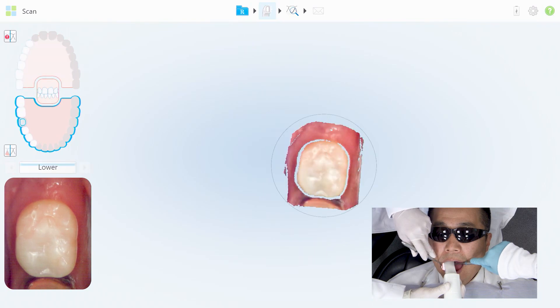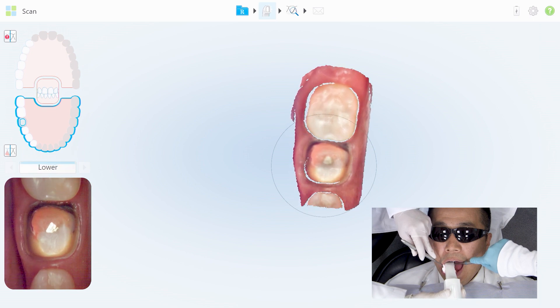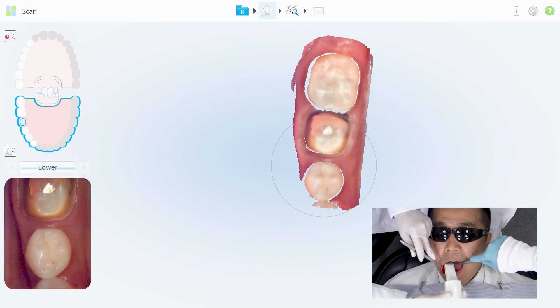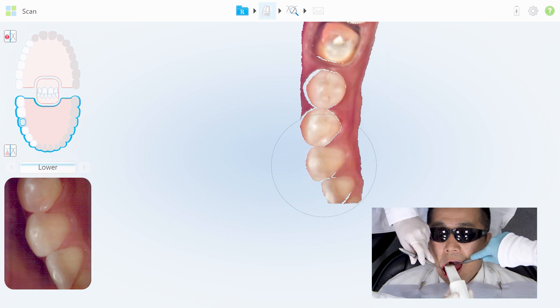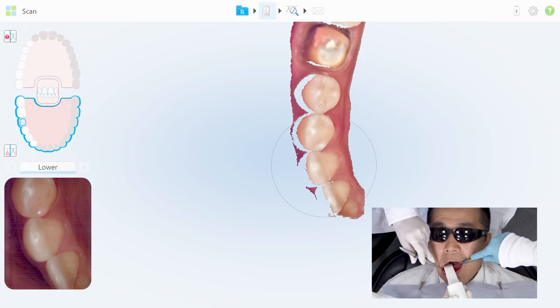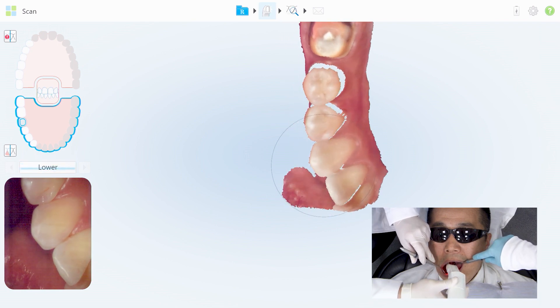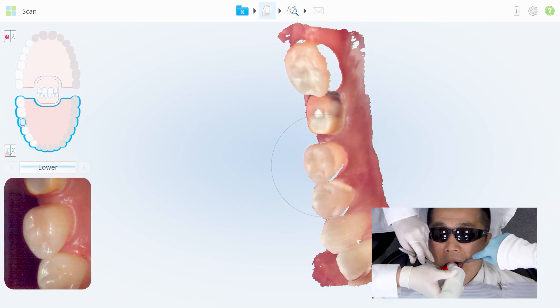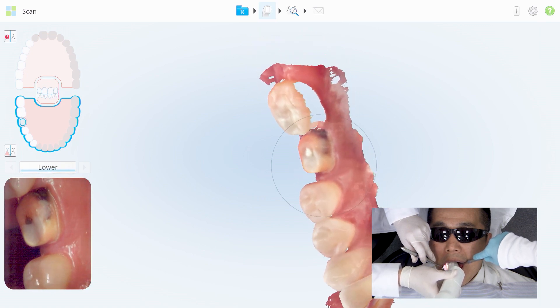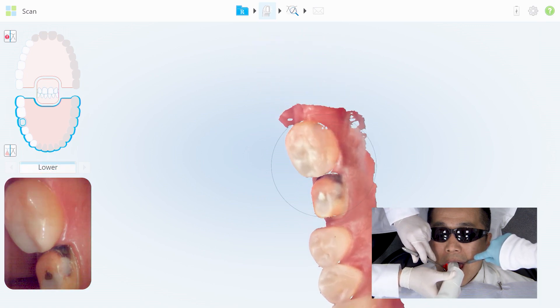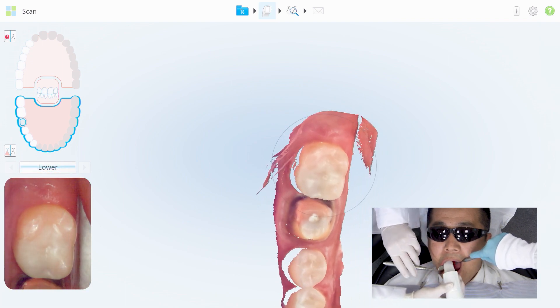Starting off over the last tooth, I activate the camera. To avoid distortions, you want to move at a smooth, relatively slow pace. I'm moving my way mesial. Once I reach the most mesial area I want to scan — which is almost always the canine for posterior situations — I'll rotate to the lingual and begin working my way back toward where I started, that last tooth number 31, moving slowly. Moving slowly and keeping it dry is going to help avoid distortions.